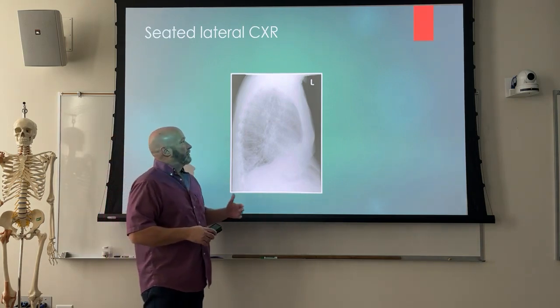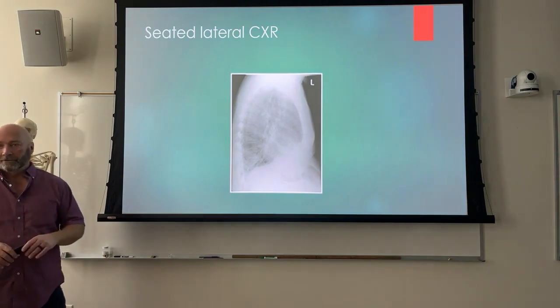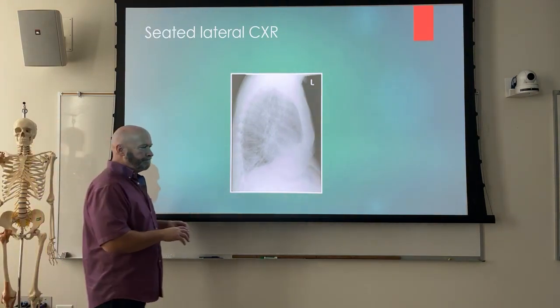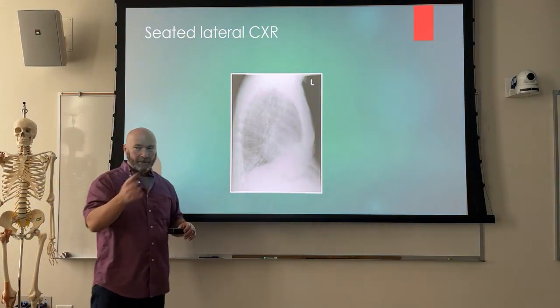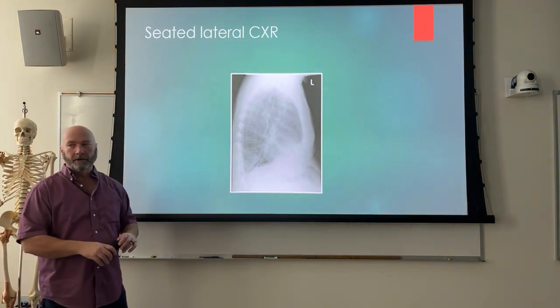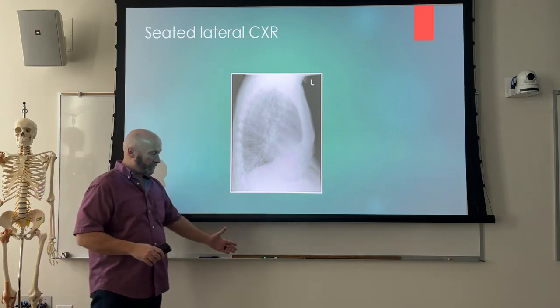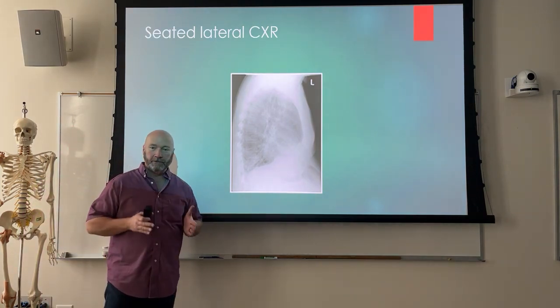So let's say you've got to do a lateral chest X-ray on a patient and they're on a stretcher. Some of y'all are plenty young that this wouldn't affect you at all, but how comfortable is it to sit with your hips all the way up against the wall and your feet straight out in front of you?